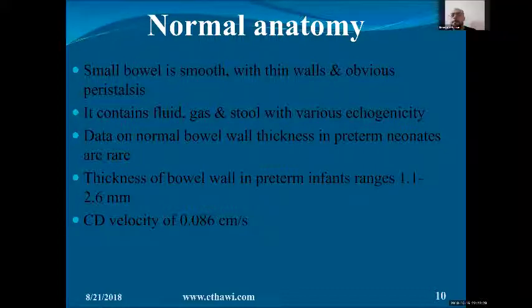Okay. So when you do Doppler, to read the Doppler, you either use it in trace, and remember we have positive and negative trace, or you make it color Doppler. When there is no aliasing, you see red and blue, very good colors. When there is aliasing, you will see many other colors.